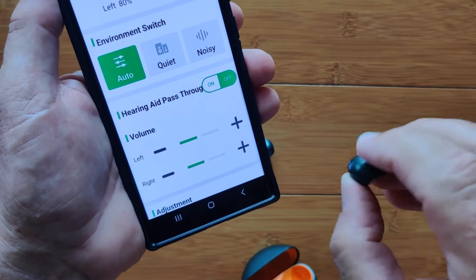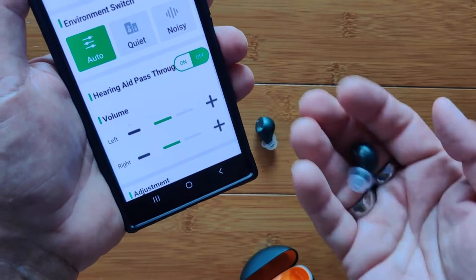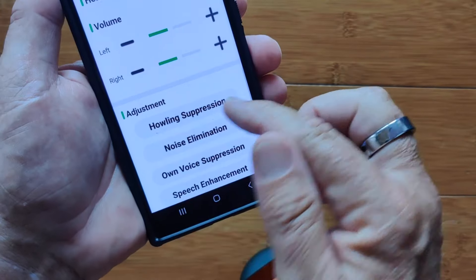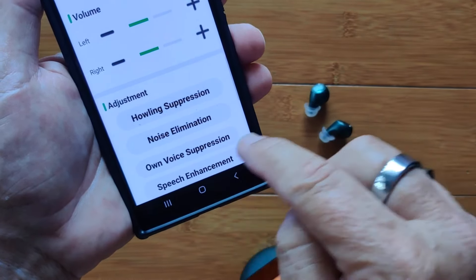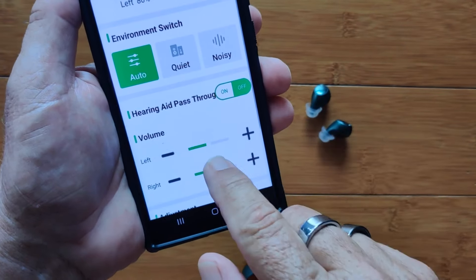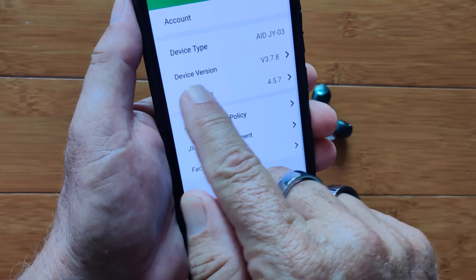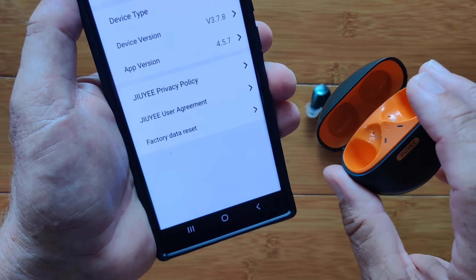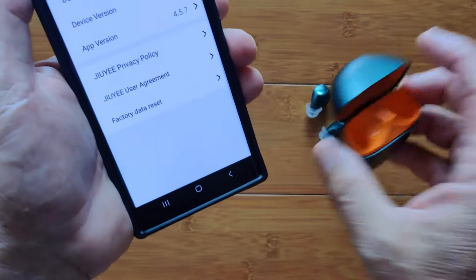When you put this in your ear and position it, if you accidentally touch the button you'll change the volume and have to cycle through everything. So for just a simple stick-in-your-ear-and-go approach, everything controlled in the app is really a good method. You also have howling suppression if you get that squeal thing that sometimes happens when it's not seated tight enough, noise elimination, your own voice suppression if hearing your voice echoing is a problem, and overall speech enhancement. Definitely check the device version and make sure it's on the latest firmware, as they come out with a couple of little bugs that an update will clear up so they work perfectly.